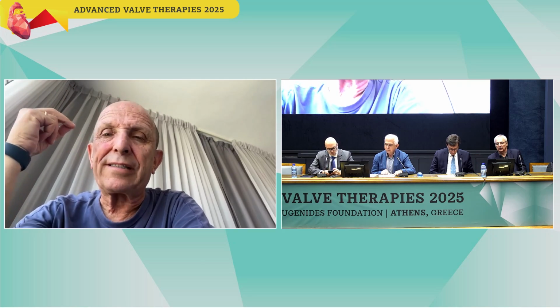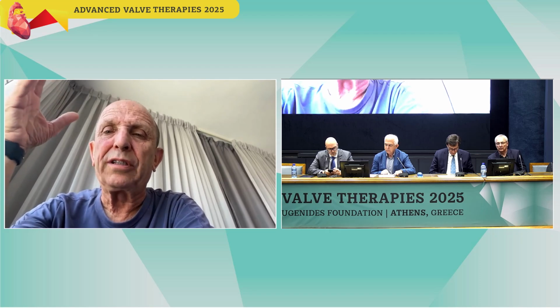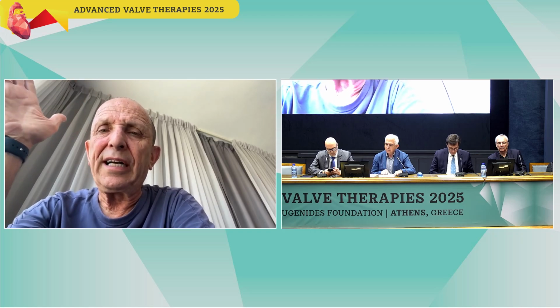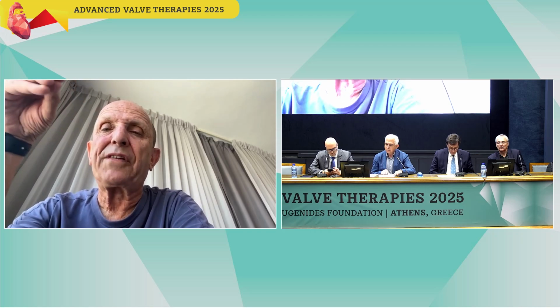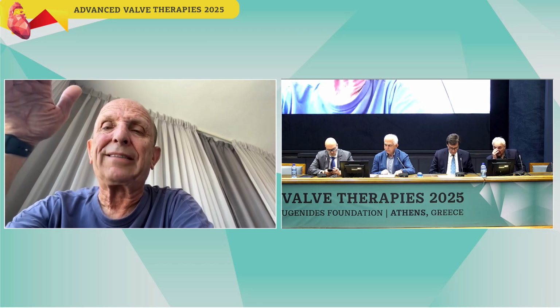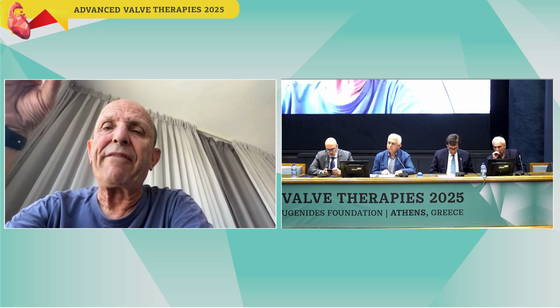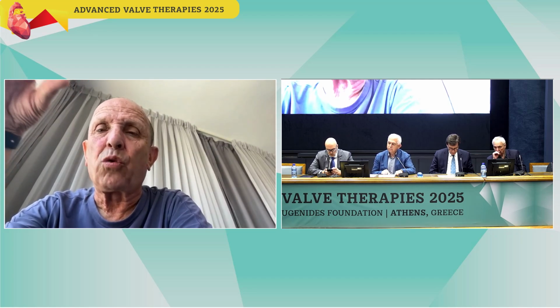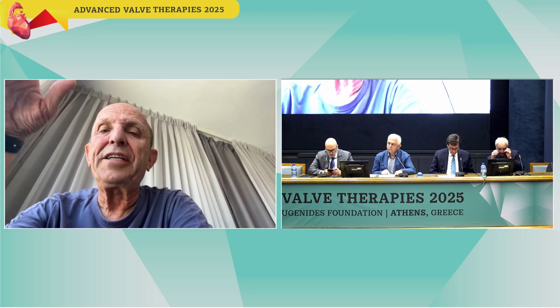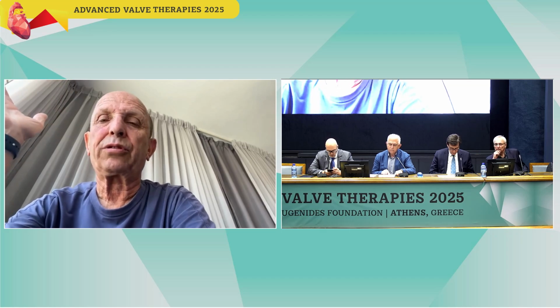But if you are using a self-expandable, the pre-dilatation should be with a much bigger balloon because bicuspid is a different animal. In a bicuspid, even the self-expandable with the best radial force, like Evolut, never ever opens the bicuspid as you want it to. The only way it will open without an absolute need for post-dilatation is to do a pre-dilatation with a bigger balloon. That's what I'm saying.